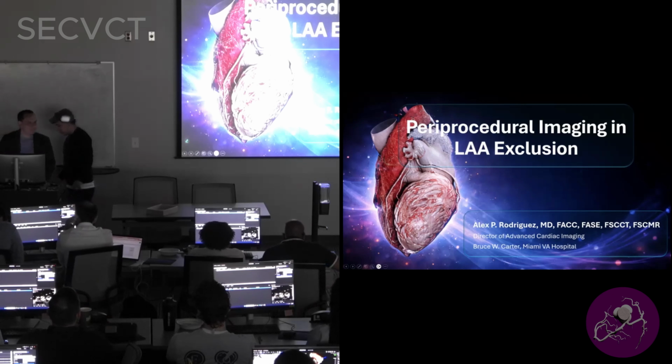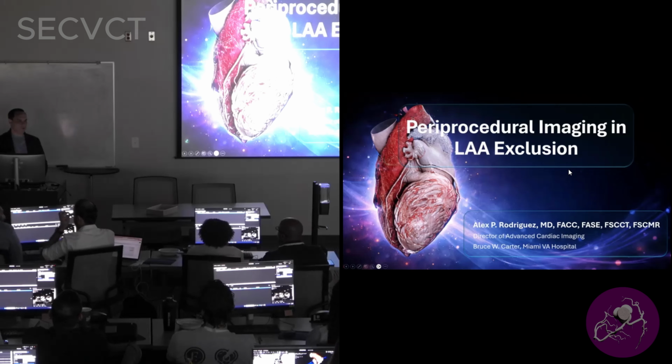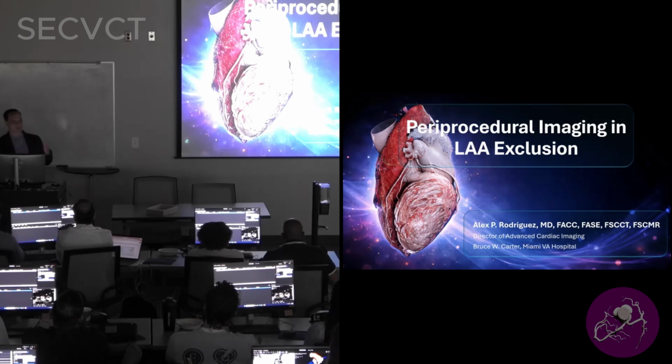Good morning, everyone. I wanted to do something a little bit different this year because Dia and I got some good feedback last year when we did multimodality imaging towards the end of the second day. I wanted to correlate the pre-procedural planning with CT to intra-procedural imaging to post-procedural imaging, and bring a couple of multi-imaging modalities together for different cases. First off, I wanted to give some credit to TeraRecon for that beautiful picture.